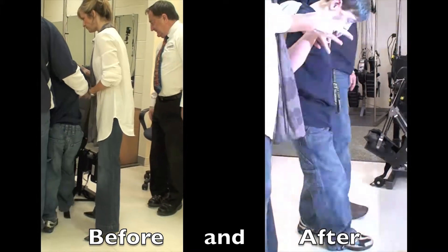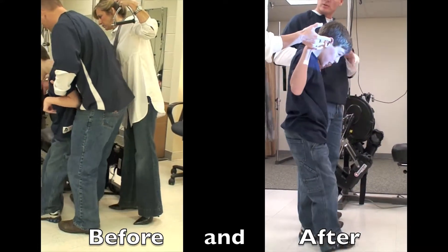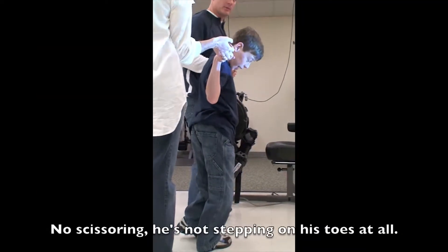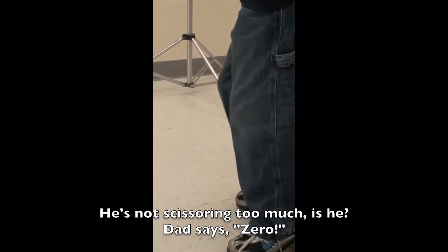That's awesome. Look at that step — I'm just turning. That's much better than I would have thought. He's pulling me a lot, but there's no scissoring. He was stepping on his toes before. Not at all now. But he's not scissoring too much, is he? Zero.